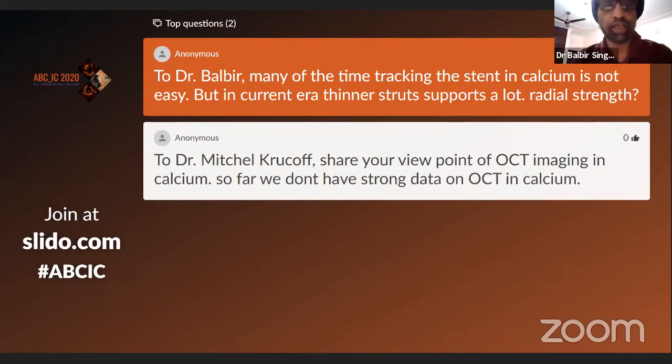But I would clearly like to use a stent with good radial strength to handle calcific lesions, because you will need high pressure balloon dilatations. You may fracture these stent struts. You may damage the polymer when you go to very high pressures. So a good radial strength stent is important. And use of guideliners or other things may help, but preparing the bed is the most crucial thing for the stent to reach. So don't rely on thin struts to reach there. Rely on preparing the bed to help you go there.